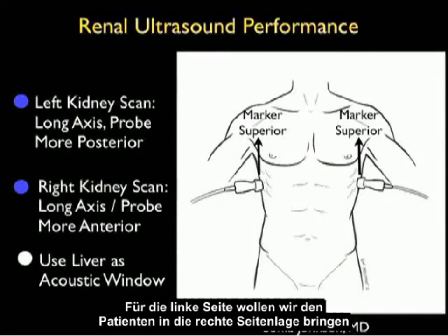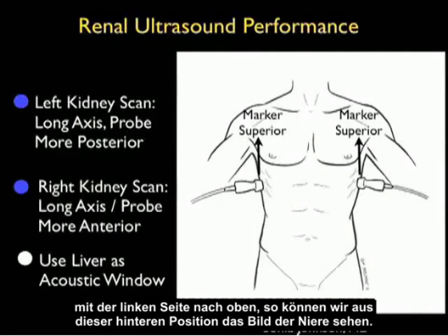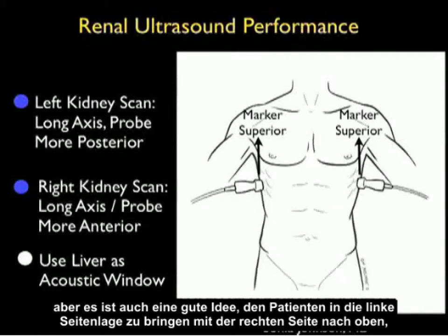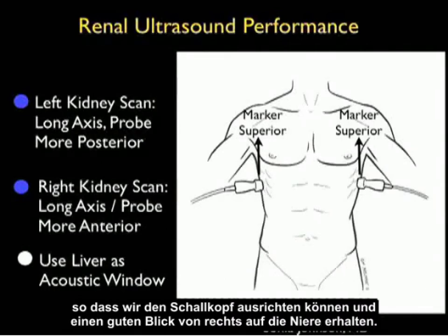For the left side, we want to put the patient in the right lateral decubitus position with the left side up, so we can come in from that posterior position and image the kidney. On the right side, we can come in from a little bit more anterior, using the liver as our acoustic window. It's also a good idea to put the patient in the left lateral decubitus position with the right side up so we can angle the probe and get good views of the kidney.